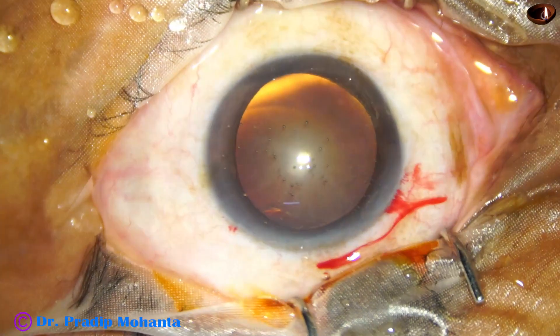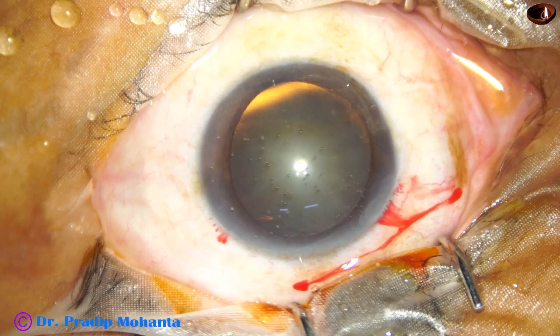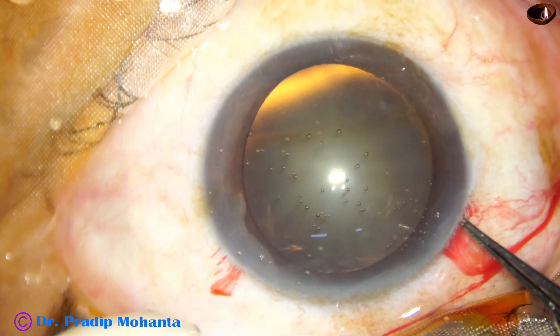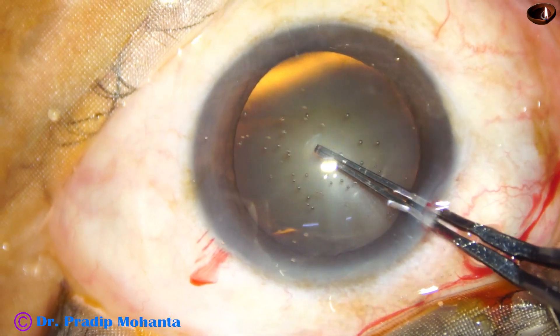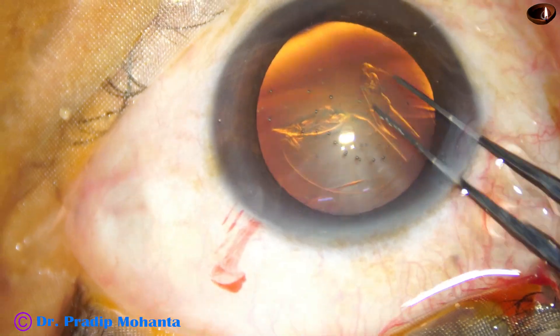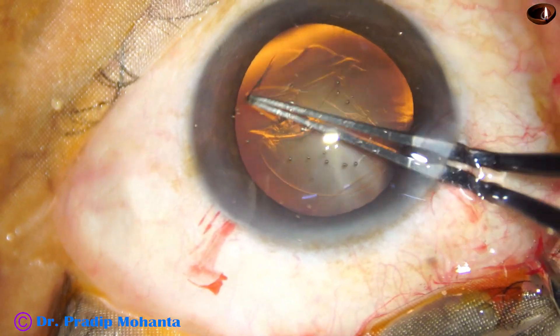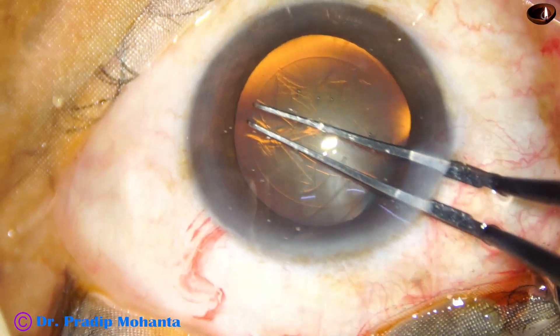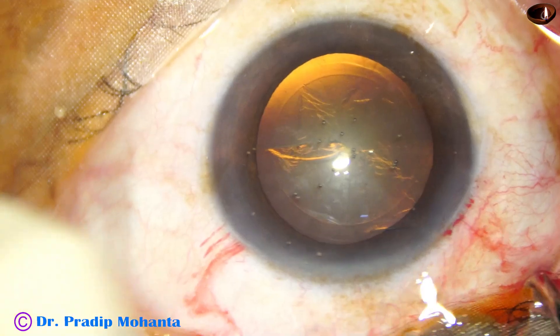This is a soft cataract. Nuclear sclerosis is about grade 2. We have made the incisions and now we are going to do capsulorhexis. Utrata forceps is being used to do the rhexis, and this movement I have learned from Dr. Neto.